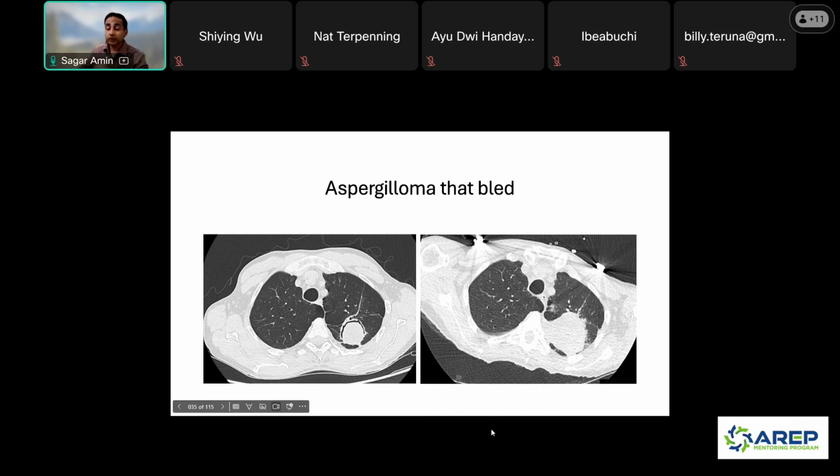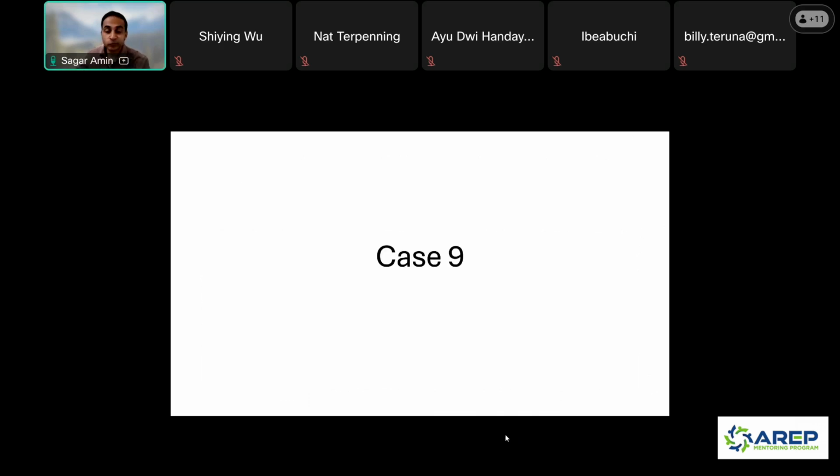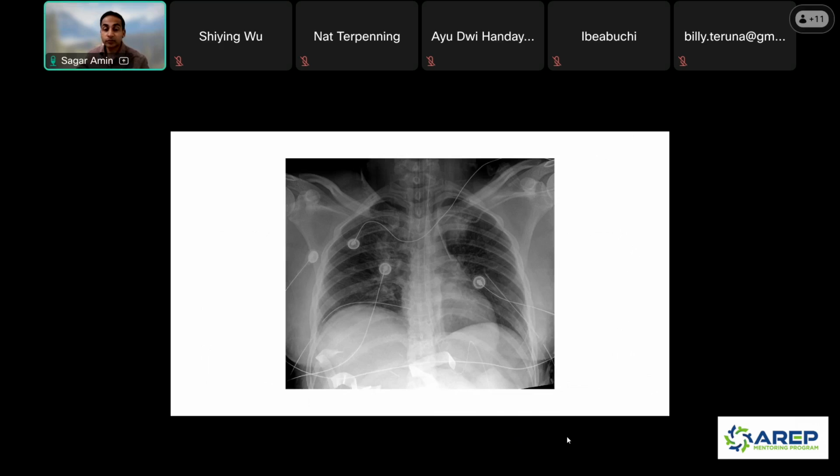Any questions on that one? All right, we'll move on to the next case. Case 9.